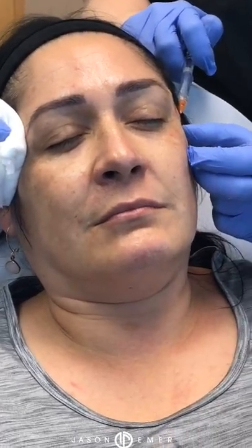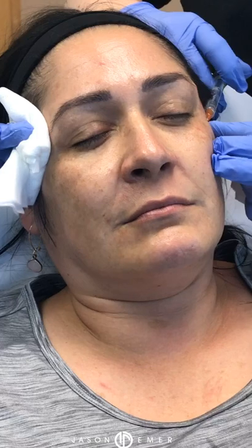And always people will ask me how much volume is needed per side. On average, if you really want to see something, especially with the lateral cheek, you're going to need a few syringes. She already has a really nice shaping. We've done fillers about 6 months ago or so. So for her, this is a touch-up, and it's just blending and balancing. But if you pull up a picture of Kim Kardashian or a Victoria's Secret model, they have a super high cheekbone and it's very shadowed, you're going to need numerous syringes. One syringe is only a very small amount, not a ton of volume.